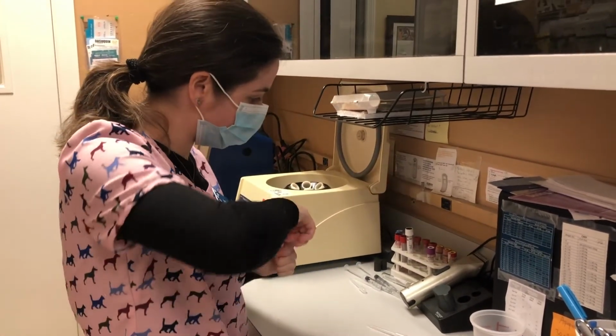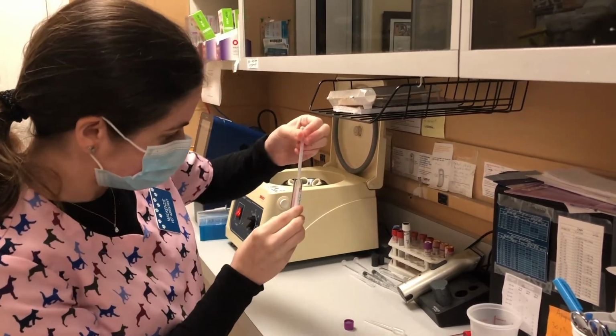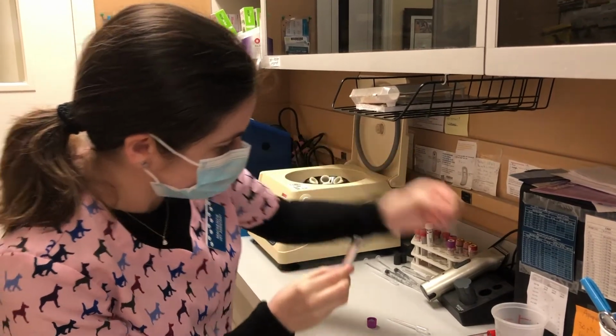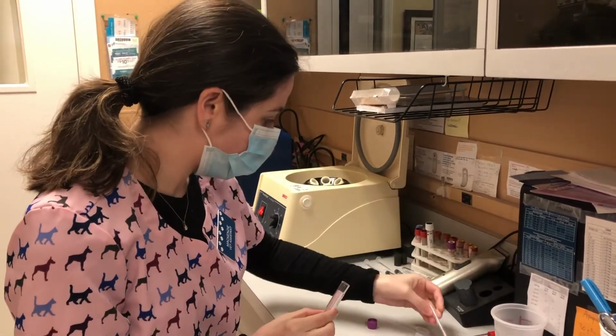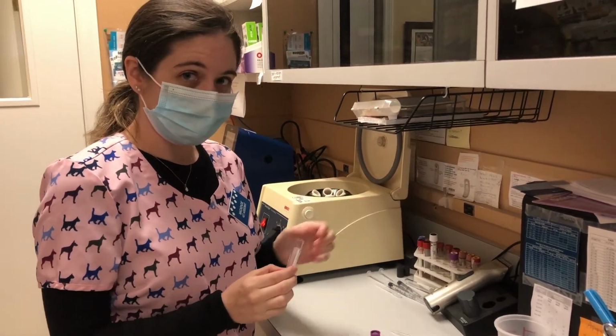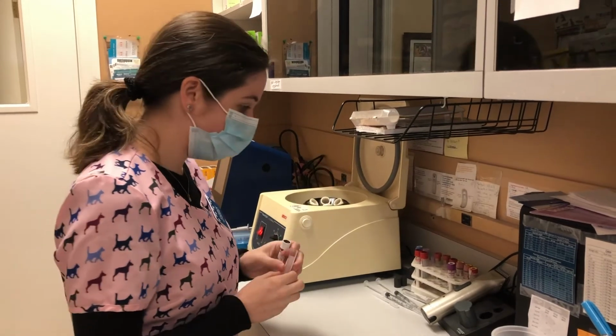Now I'm going to do my recipient. Now I'm going to place about 2 drops of my packed red blood cells into these plain tubes.